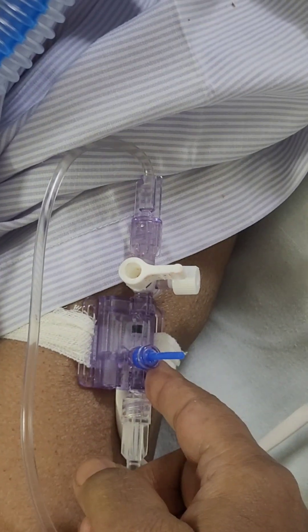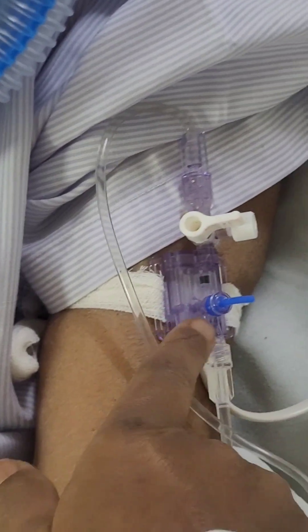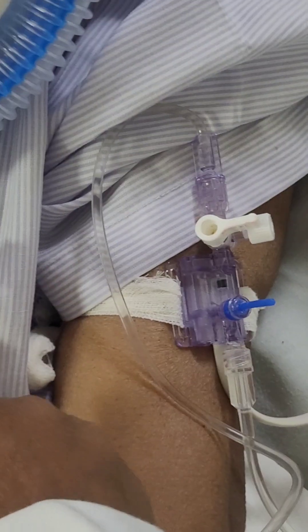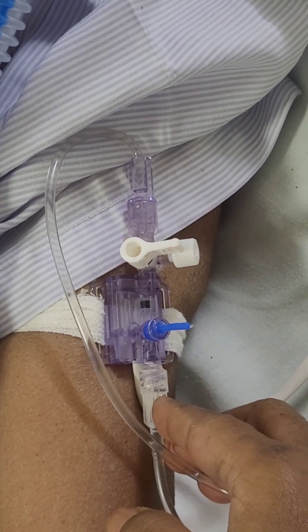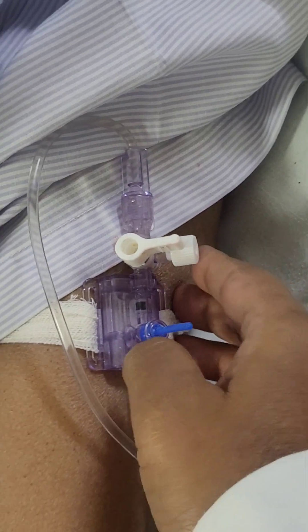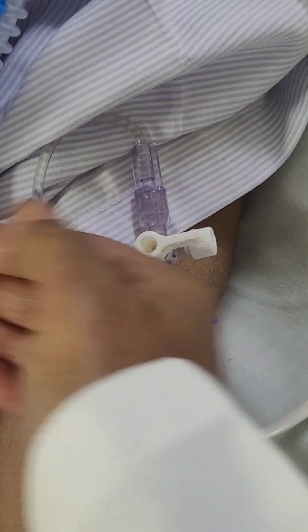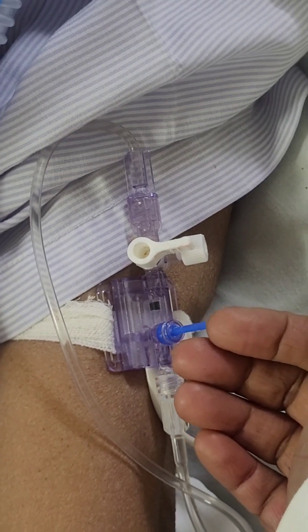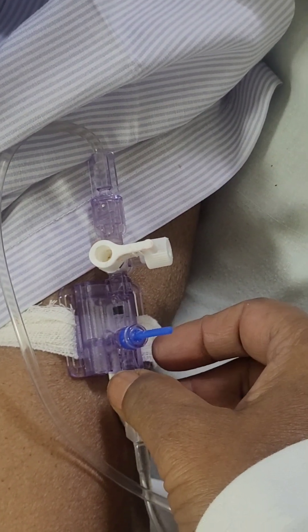This is the transducer. You have to keep it at the phlebostatic axis, which is at the level of the fourth intercostal space, mid-axillary line. We attach it to the arm, and generally when the patient is in a prop-up condition, you will get it at the same level as the phlebostatic axis.